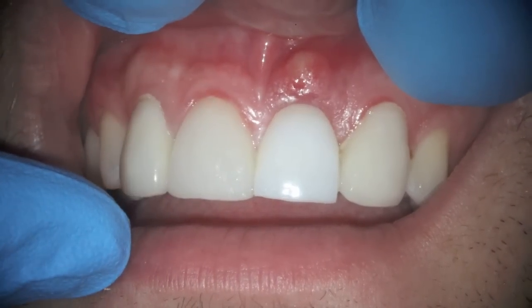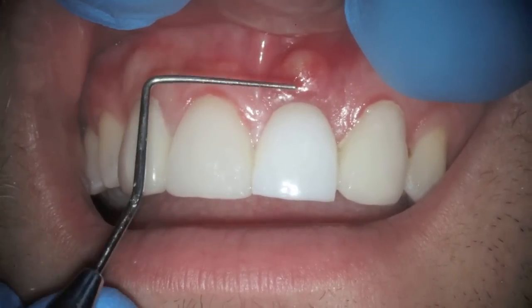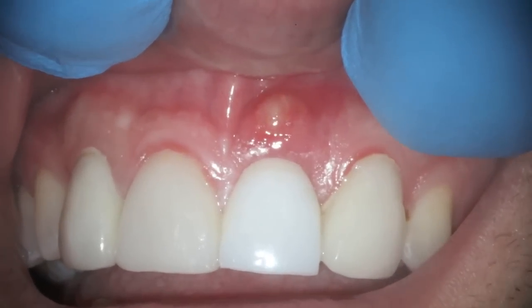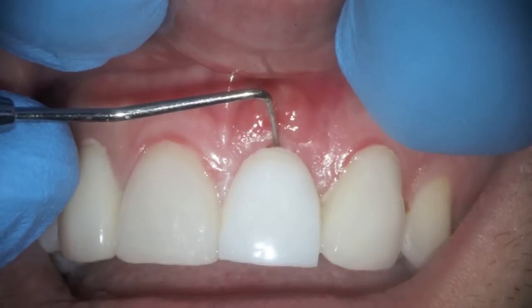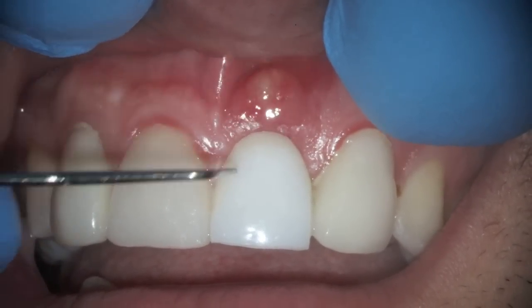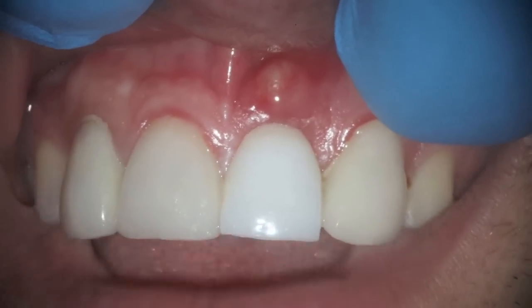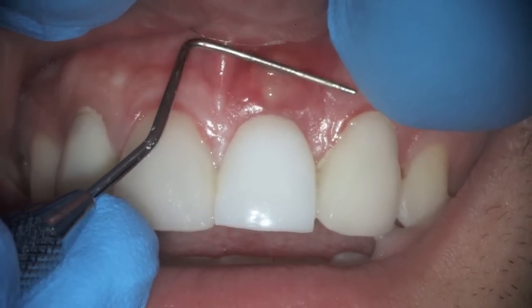You can see the pus pocket there. We go ahead and you can see the exudate and the pus that comes out. There's not a huge amount there, but nevertheless, it's fluctuant. That was a lab fabricated temporary. You can start seeing the pus though that's being brought out there.